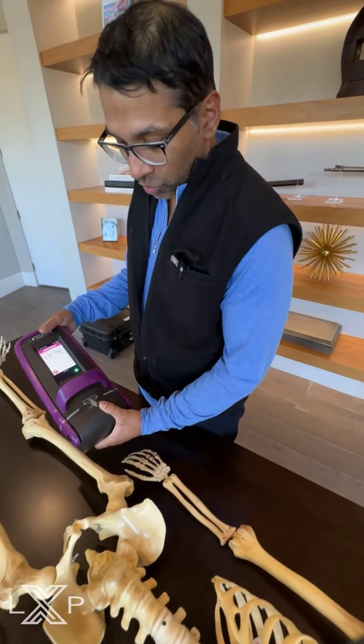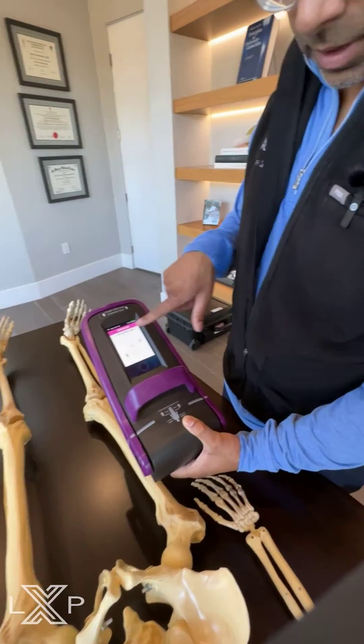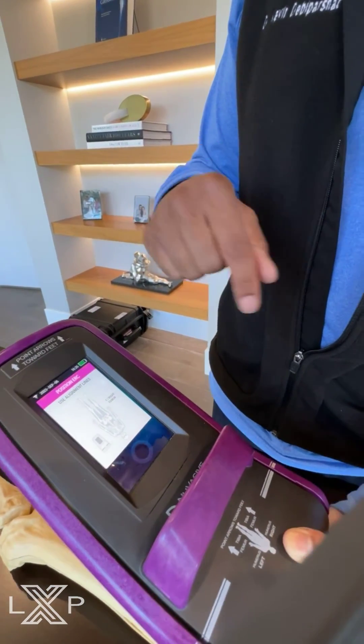The patient will actually position this onto the leg wherever the implant is placed — in the thigh or in the lower leg — and it will explain everything that you need to do. You position it into that area, then push the button, and that will facilitate the lengthening to actually occur.